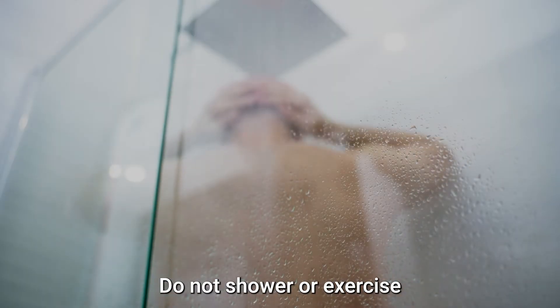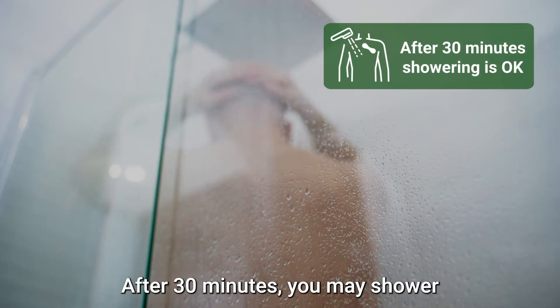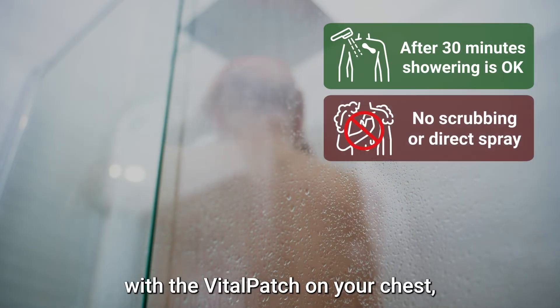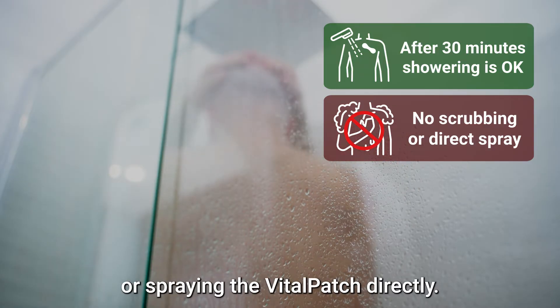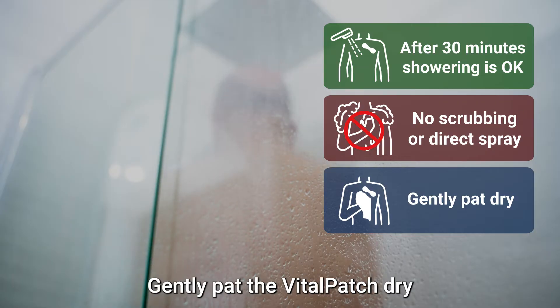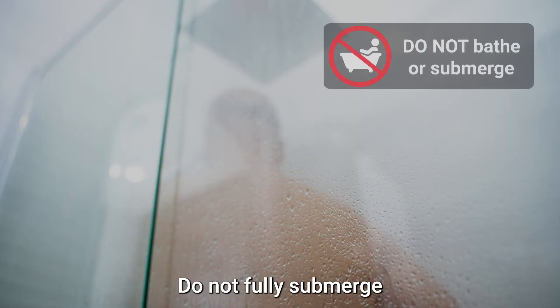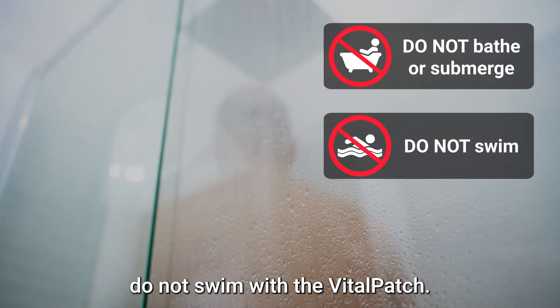Do not shower or exercise for the first 30 minutes while wearing the Vital Patch. After 30 minutes, you may shower with the Vital Patch on your chest, but avoid scrubbing the area or spraying the Vital Patch directly. Gently pat the Vital Patch dry after showering. Do not fully submerge the Vital Patch in a bath and do not swim with the Vital Patch.